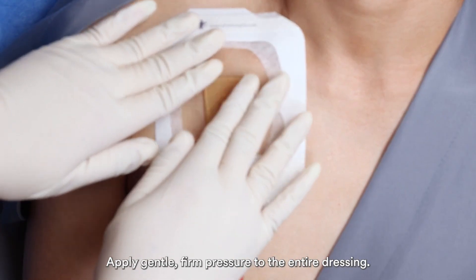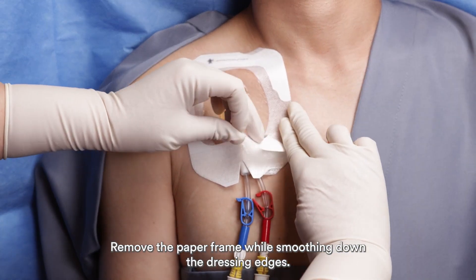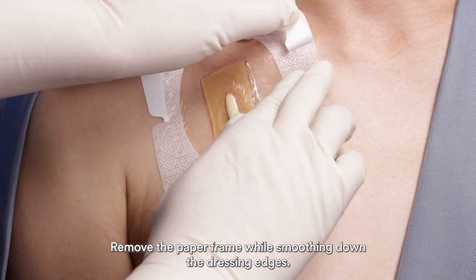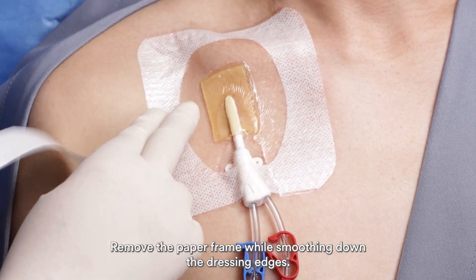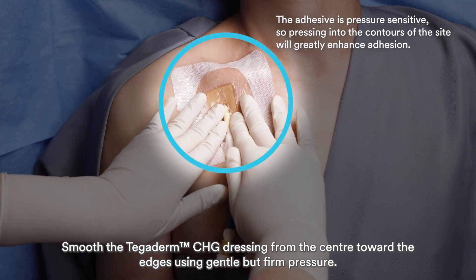Apply gentle, firm pressure to the entire dressing. Remove the paper frame while smoothing down the dressing edges. Smooth the Tegaderm CHG dressing from the center towards the edges using gentle but firm pressure. Avoid stretching the dressing to reduce the risk of skin trauma.